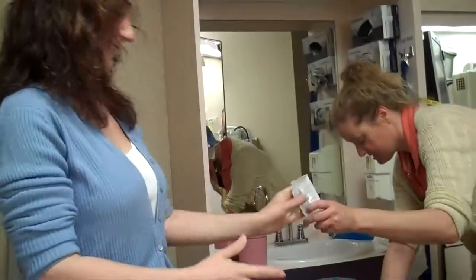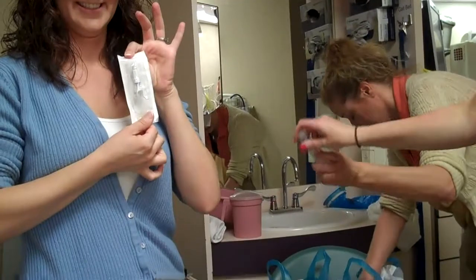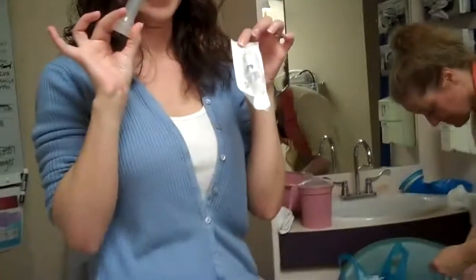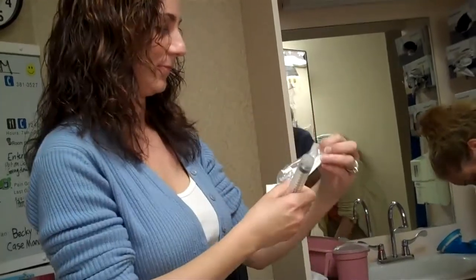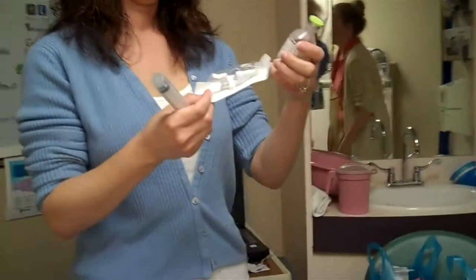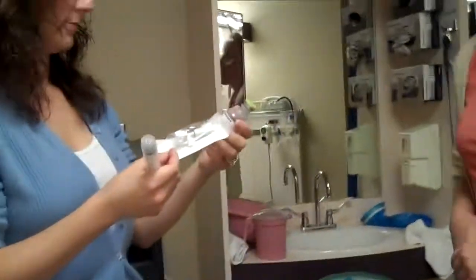So here is how you flush each line. Here's this, that's your spike. This is your syringe. This was a great idea, I'm glad you brought this. This is a needleless system.